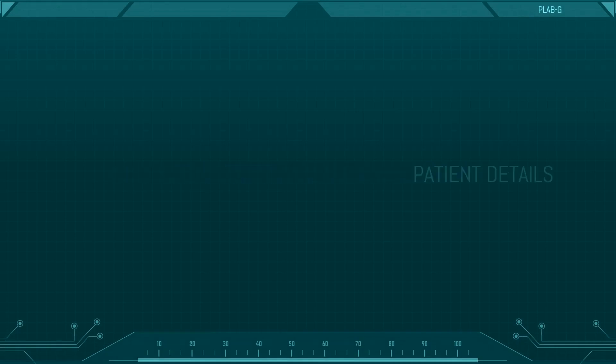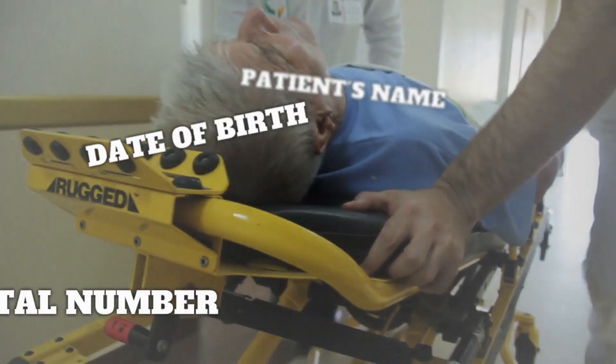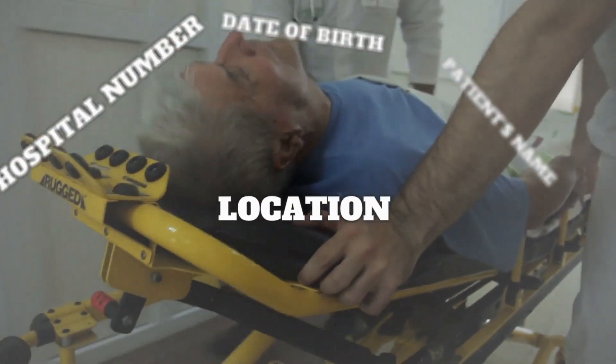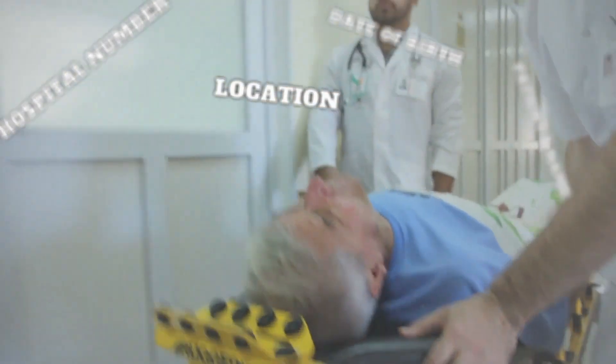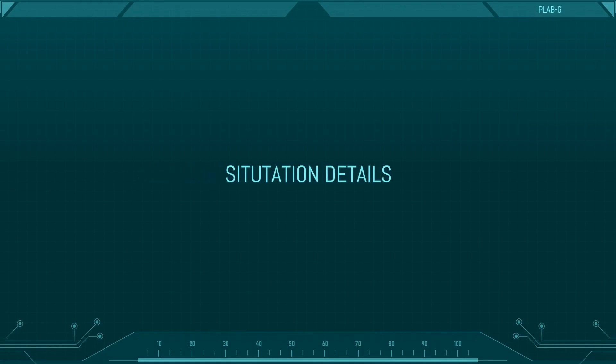Patient's name, date of birth, hospital number and location are very important. These become important as in the emergency department or acute medical setting, doctors are often shown multiple ECGs. You need to know where your patient is in order to ensure that they can be moved to a higher dependency area if appropriate.